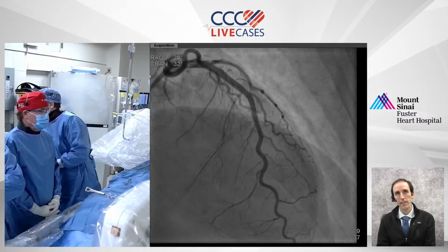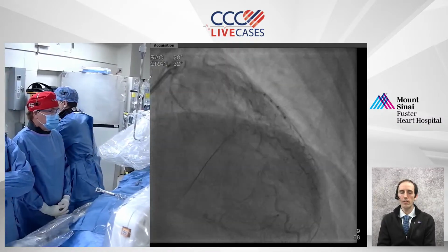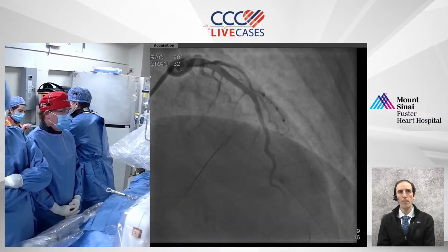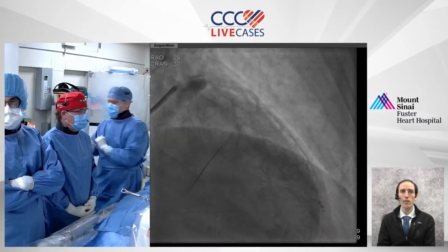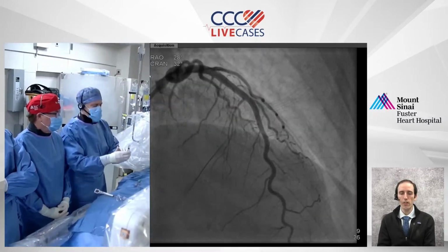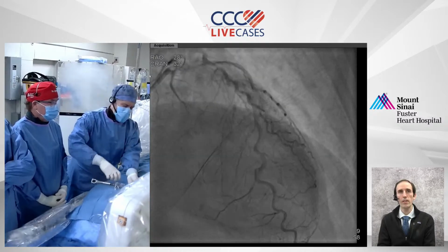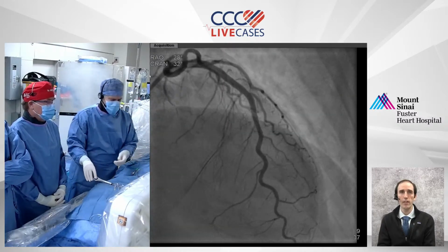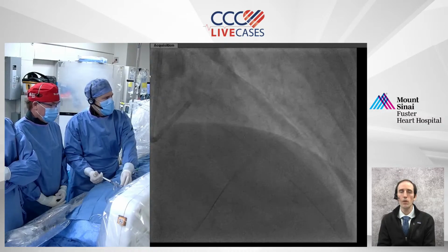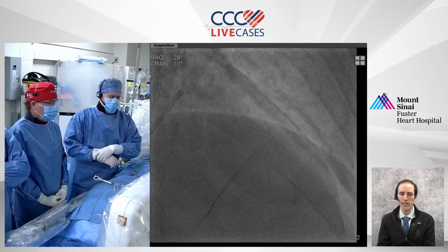We actually mix in the cath lab, but most of our cases are planned and not ad hoc. The reason is that many of the patients are on drugs that we might want to hold prior to testing, so that, again, we don't get falsely negative acetylcholine spasm testing. What's your practice for withholding meds?